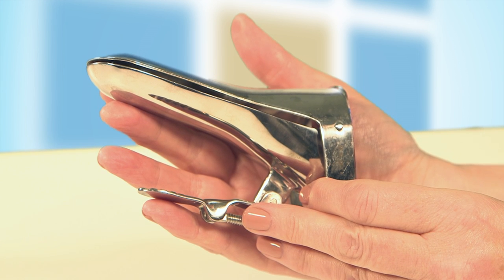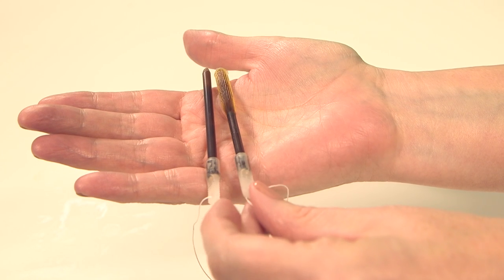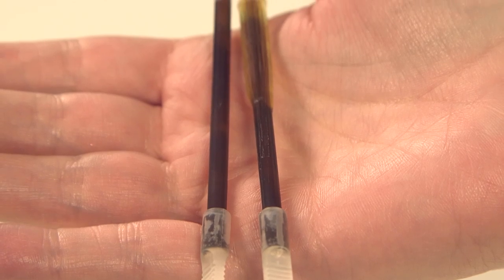Once you are asleep, your legs will be placed in supports and the doctor will examine your womb. A speculum will be inserted into your vagina. The cervix, which is the neck of the womb, may be opened with thin rods called dilators.